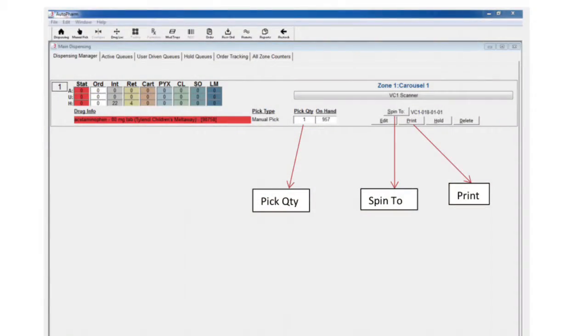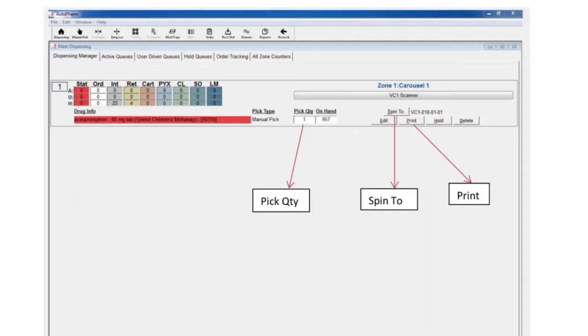The spin to button allows the user to spin the carousel directly to the selected shelf if it didn't automatically spin on its own. The print button will reprint the label if you need another one or a quantity was changed.